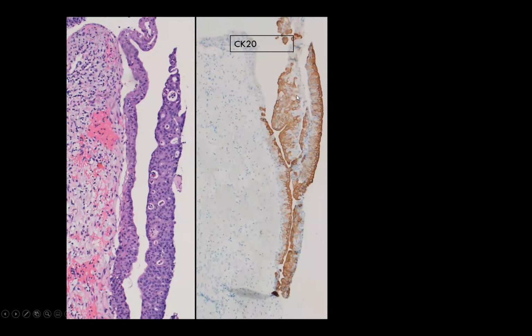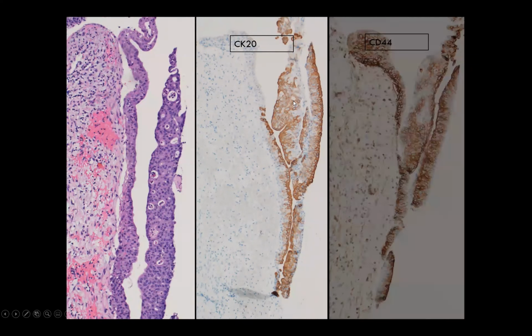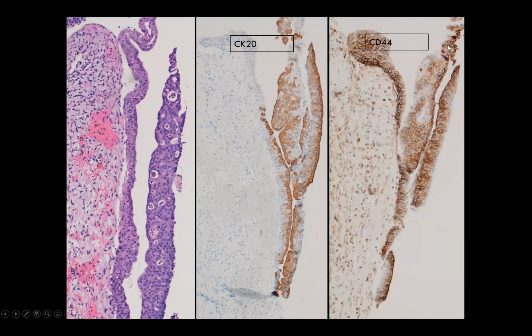And so once one sees this, you might think, okay, this is carcinoma in situ. But when you do the CD44, you will see it shows almost a similar pattern. Also, almost full thickness staining like you would see in a reactive condition. So how does an immunostain help in this condition to call it CIS versus reactive? You just cannot, right? So immunostains are not the answer for reactive versus carcinoma in situ. In some cases, they might help confirm or refute your morphologic impression, but please remember that your morphology is always number one when it comes to diagnosing these flat lesions.